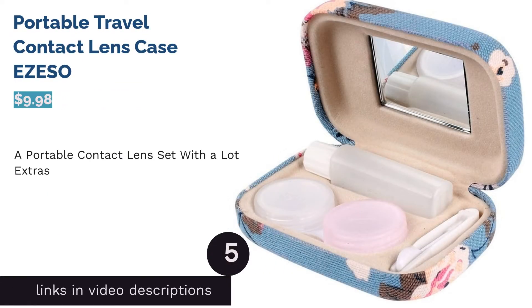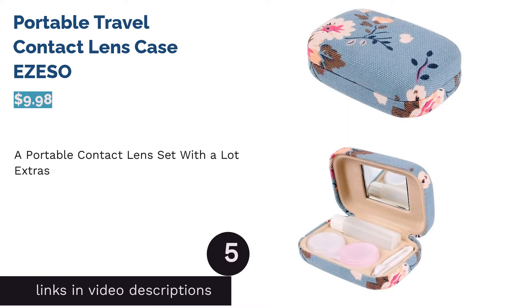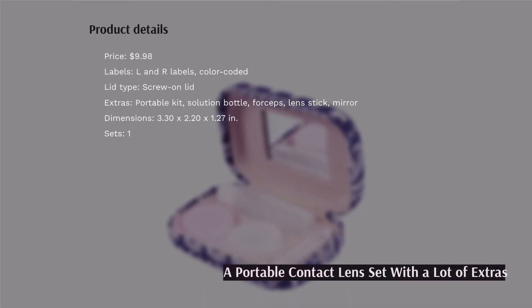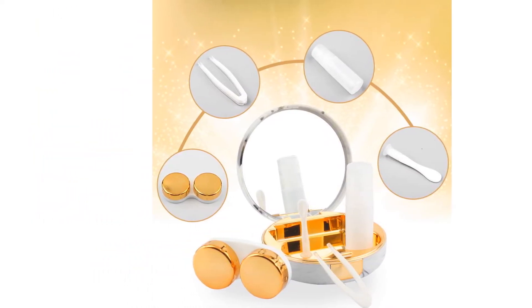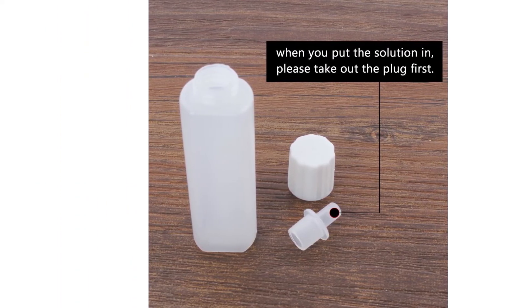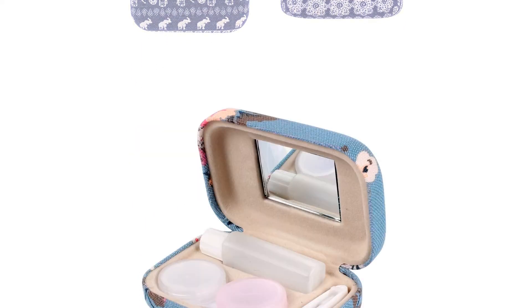The next product is the Portable Travel Contact Lens Case by Azesso. This cute portable contact lens set comes with extras that let you wear or remove your contacts anytime and anywhere. It includes a case with a mirror, a solution bottle, forceps, and a lens stick. The actual lens case has color-coded L and R labels, and the inside of the kit has a groove for each item in the set, so everything is held securely in place.